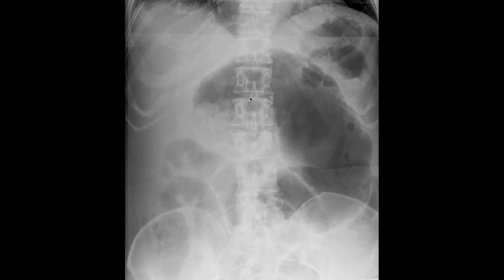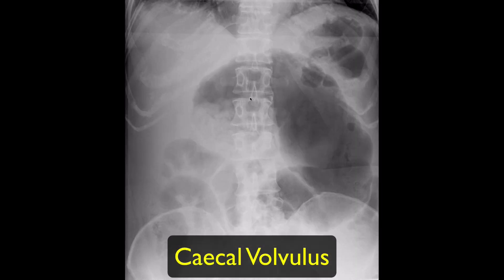This is suggestive of a caecal volvulus, with this gas-filled loop of large bowel being the twisted and rotated cecum, which has become displaced from the right iliac fossa.